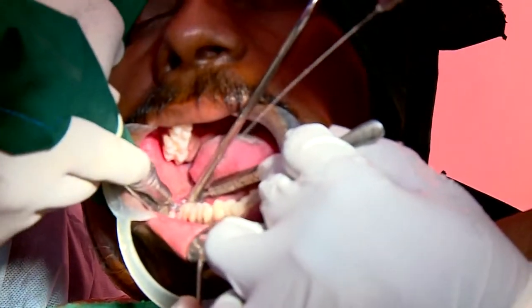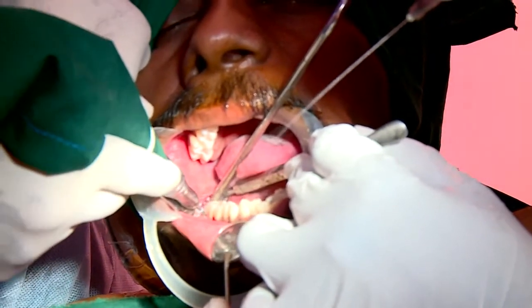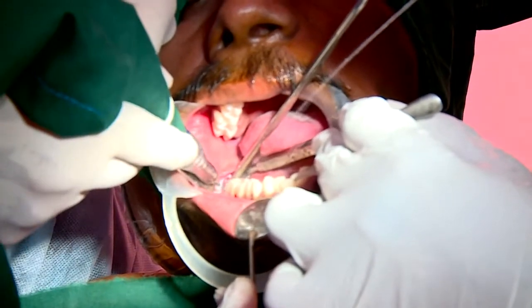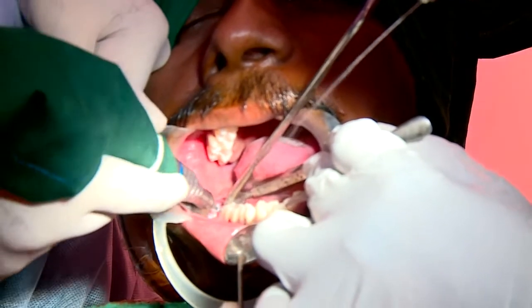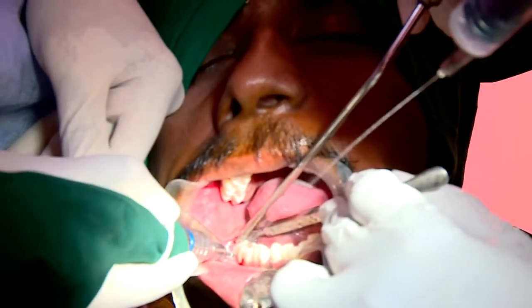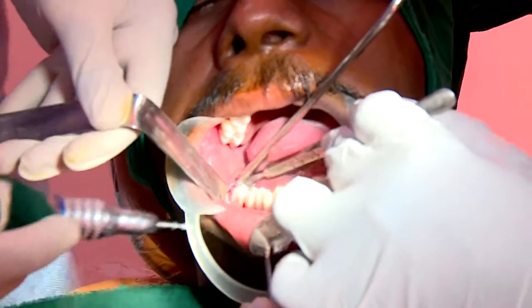During the initial stages, you can always use the hand instrument to gauge the depth on an OPG or an IOPA, to see how much of the tooth can be cut. You can measure and then cut during the initial phase. It will give you more confidence that you do not damage the inferior alveolar nerve. As you do more cases, you get a feel of how you are cutting and how the tooth will look. Initially, you can measure it in the radiograph.